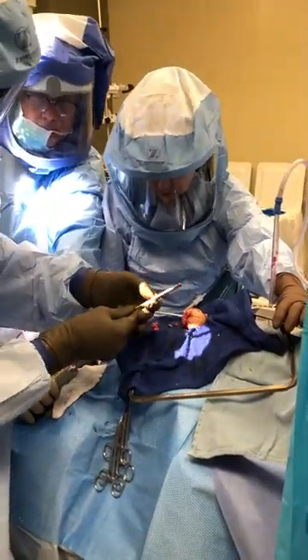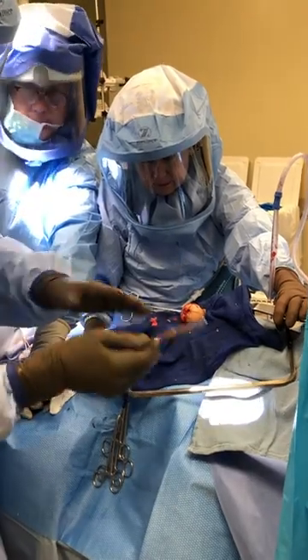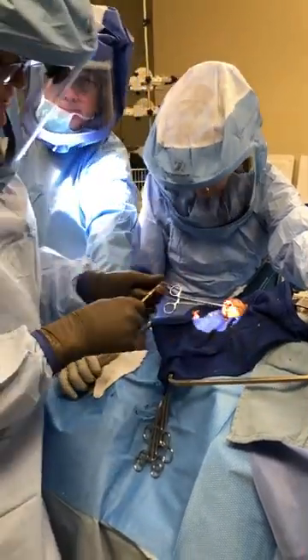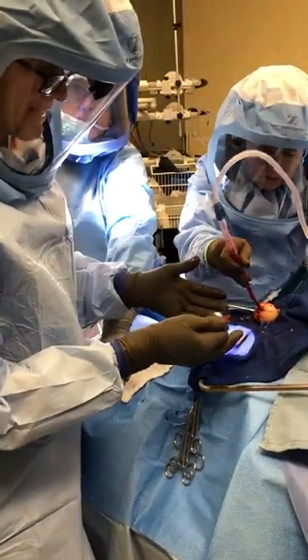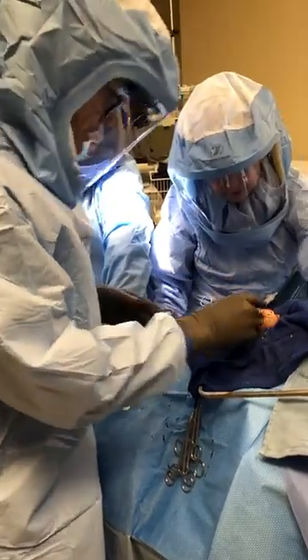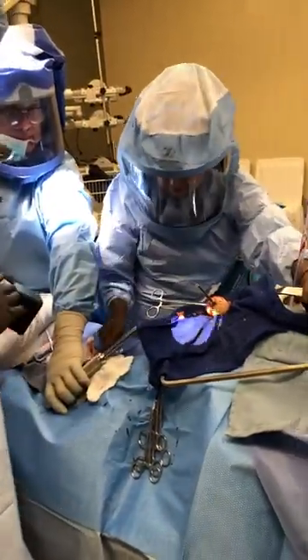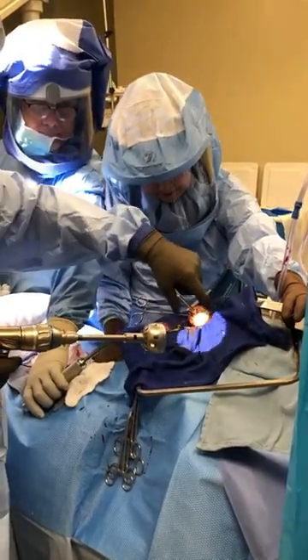So now I don't need to take any additional bone. We have the standard cut. This one is designed to take six millimeters off the top. Every implant in this system is six millimeters to apex. You've got to bring normal anatomy to do a measured resection — take off six, put back six. Keep them as anatomic as possible. I have changed the center slightly up by taking less off the top.